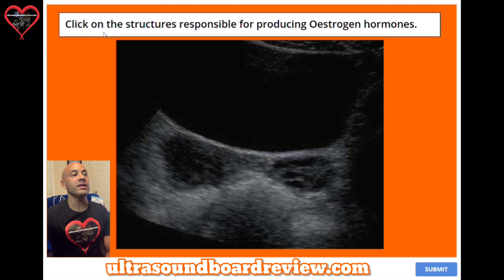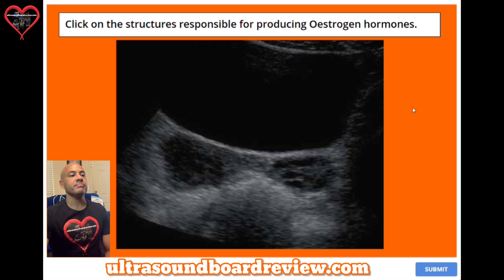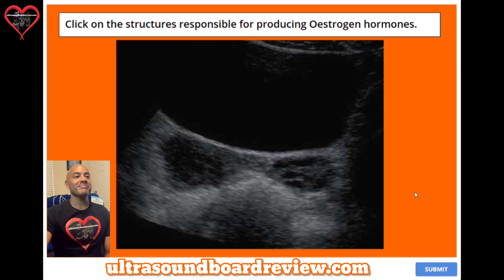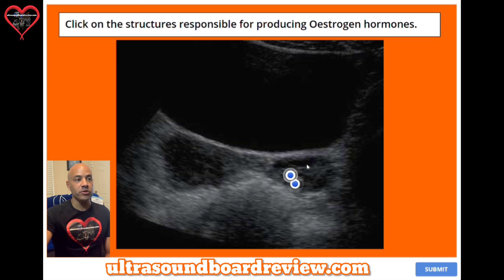Question 28. Click on the structures responsible for producing estrogen hormones. There are four follicles demonstrated in this image, and each one of these is responsible for producing estrogen.